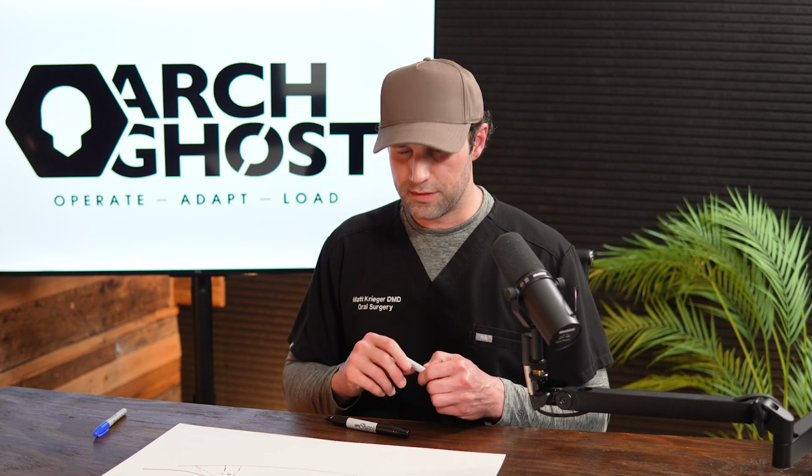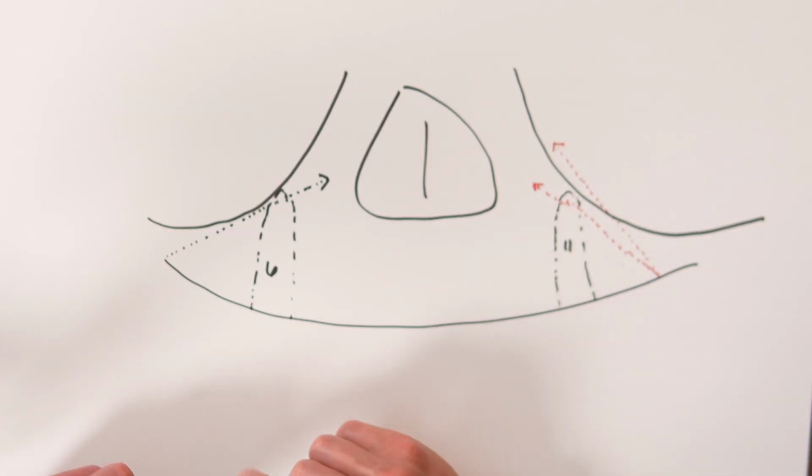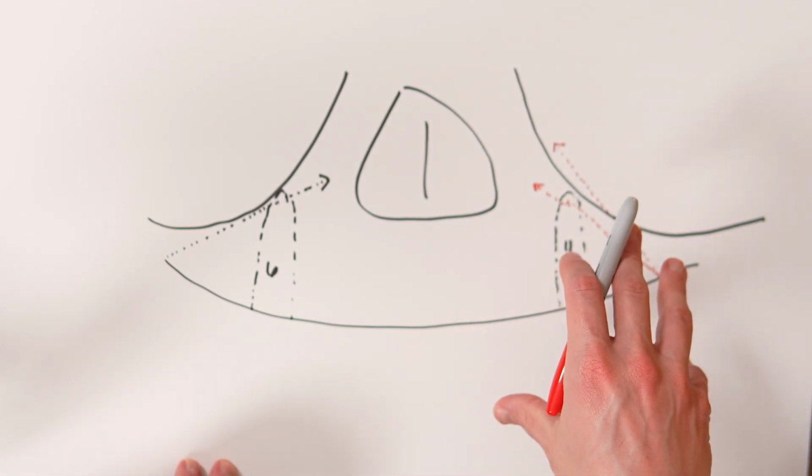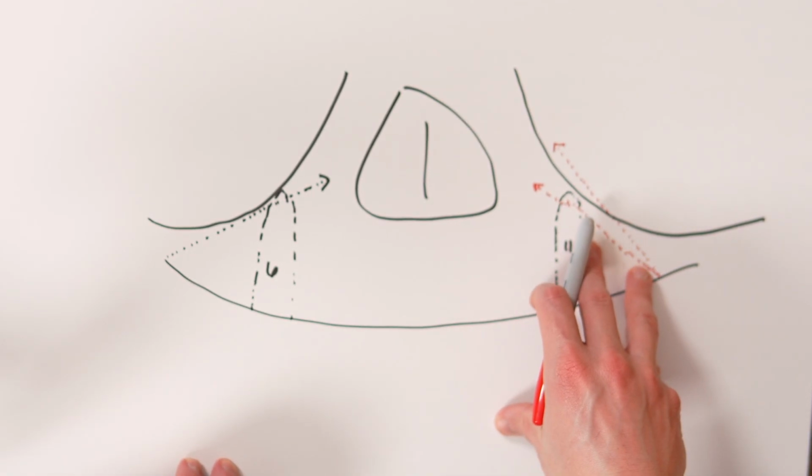So it's just a simple tool, and the benefit to this is that canine socket is when the sinus pneumatizes, and when you have cases where you really need this, it's almost always touching the sinus because that pneumatized sinus has come down to the area of that socket, but it's not going to erode the socket, right? So it comes up and pushes on that lateral wall of the socket. So very beneficial ID point, especially when you're trying to really stretch spread in an atrophic case.